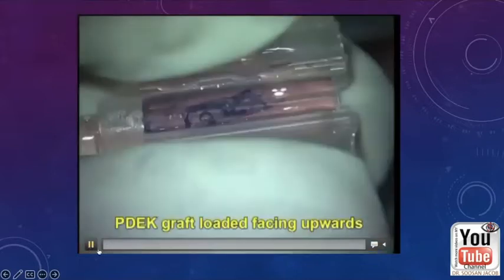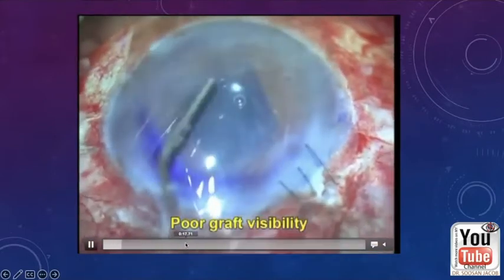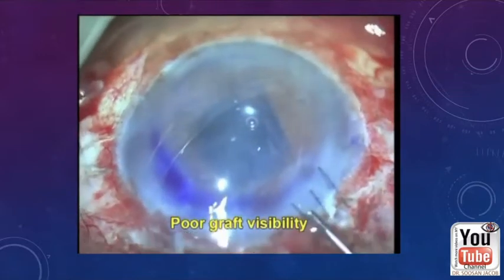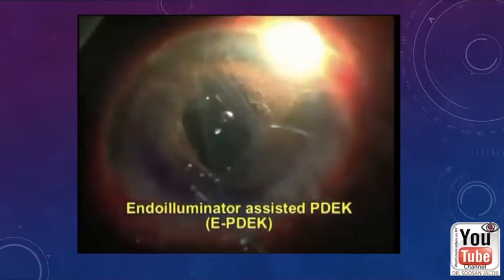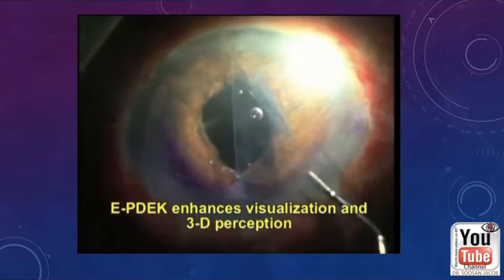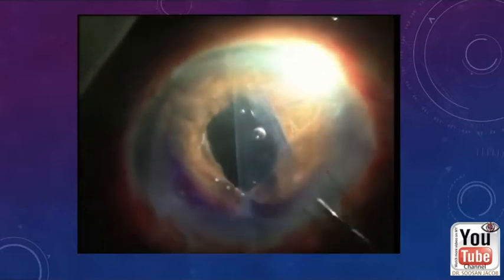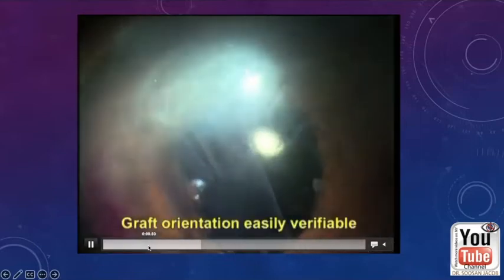And you can see this is what it does. We inject the graft in. Some of these corneas are very edematous, especially in our countries. We do not get the Fuchs type of corneas where visibility is very good, but rather we get very poor visibility corneas. And you can see that when you switch off the microscope light and you operate with just the endoilluminator light, shining light from the side, you can see it's a much better visibility.